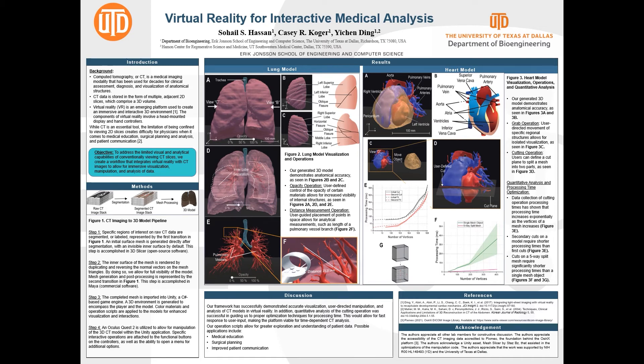Overall, our developed framework has successfully shown enhanced accurate visualization, manipulation, and analysis of CT data in virtual reality. Our quantitative analysis of the cutting operation has allowed us to find optimization methods for processing time, meaning fast, almost immediate response to user input, making the overall VR experience feel more immersive and enjoyable.